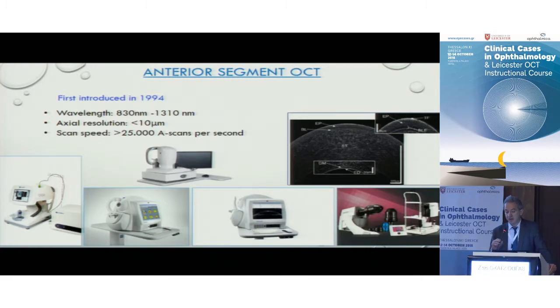The average anterior segment OCT device achieves an axial resolution of 4 to 6 microns with an excellent scan speed. These are the devices that we use in my department: the OptiView, the Cirrus, Visante, the Spectralis, and the new swept source OCT, the Casia OCT, which, as you may know, is now also dominating anterior segment imaging with its advantages.